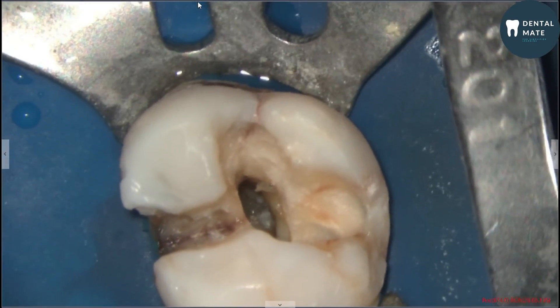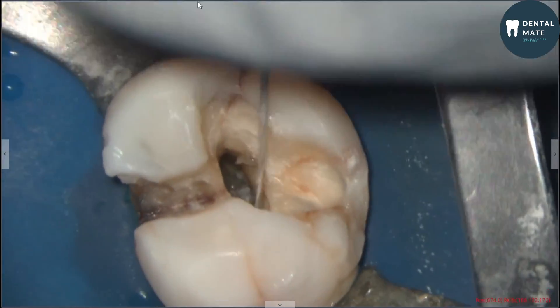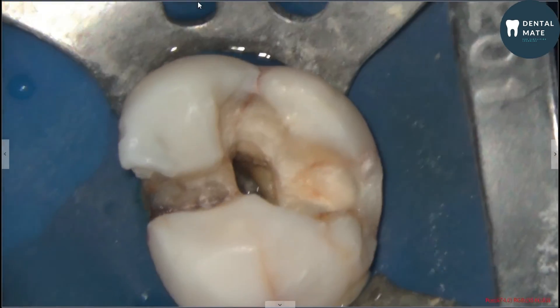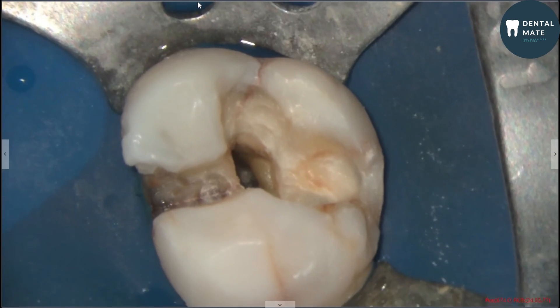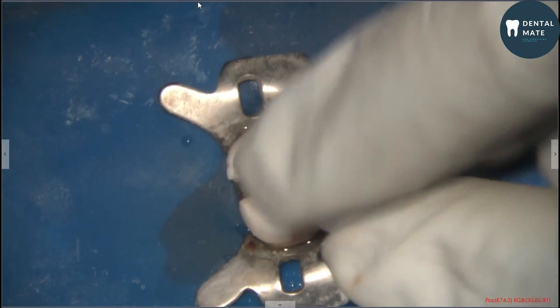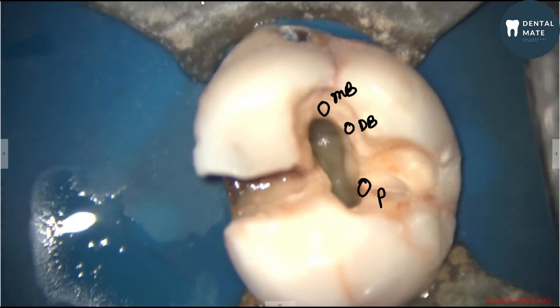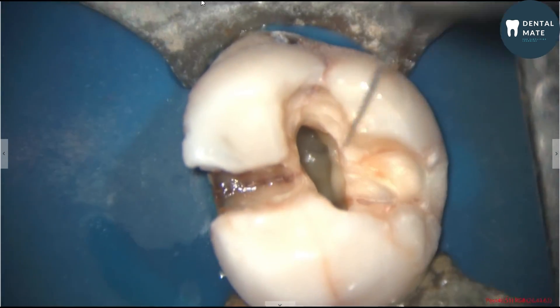Initially, we'll have a triangular opening after de-roofing the pulp chamber. Now I'll scout for the canals. Here — this is the palatal canal, this is the mesiobuccal canal, and this is the distobuccal canal. One pro tip while locating canals in a maxillary molar: for the palatal canal the handle of the hand file is located buccally; for the mesiobuccal canal, distolingual; and for the distobuccal canal, mesiolingual — the handle is directed opposite to the canal location.